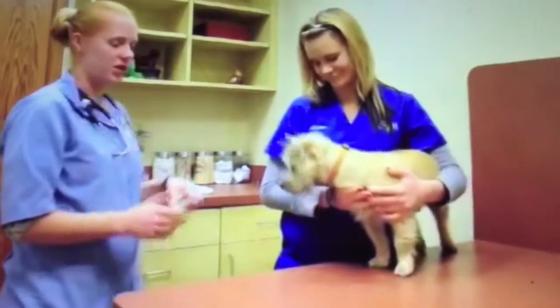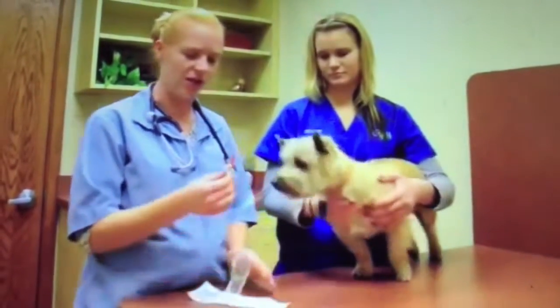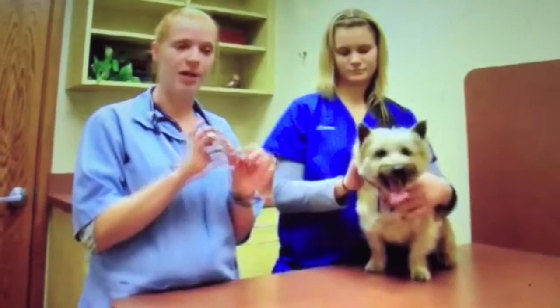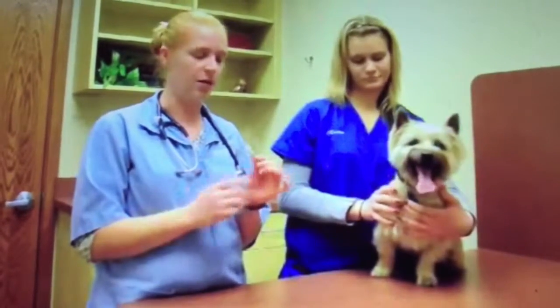So the microchip is just given almost like a vaccine. It's typically already packaged in a little needle. The needle is a little bit bigger than the ones we use for vaccines and blood draws and that kind of stuff. And the needle's just put under the skin, and then the microchip is expelled under the skin, and the dogs are then microchipped.